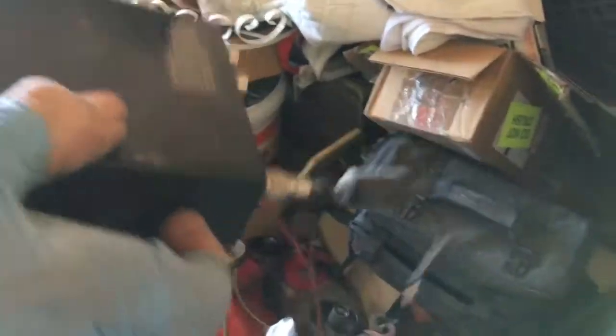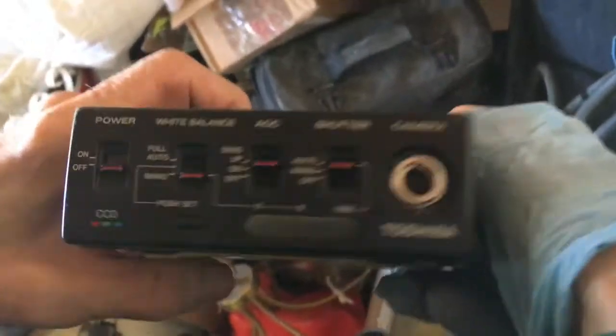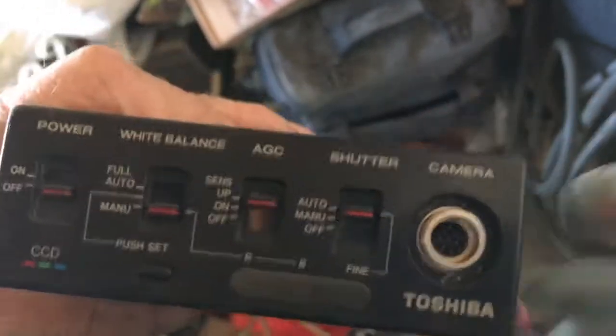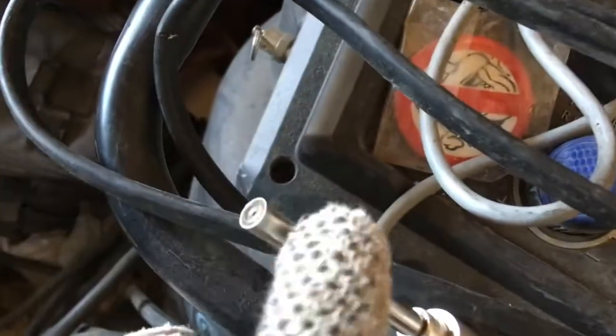This is a CCD camera. You could have a camera attached — this is actually the camera part right here. And the light is there too, so this is the camera and the light together.